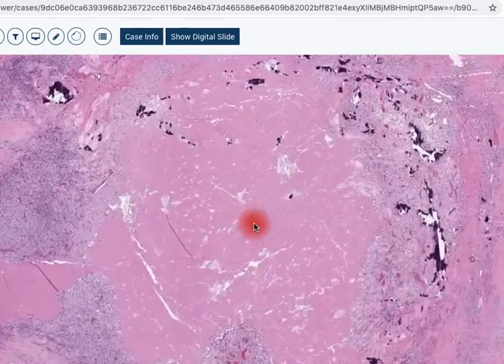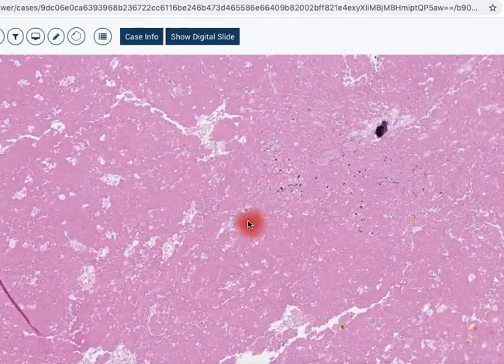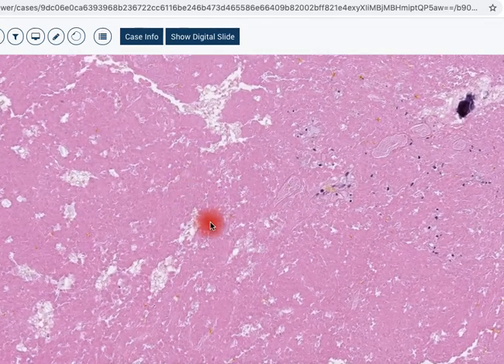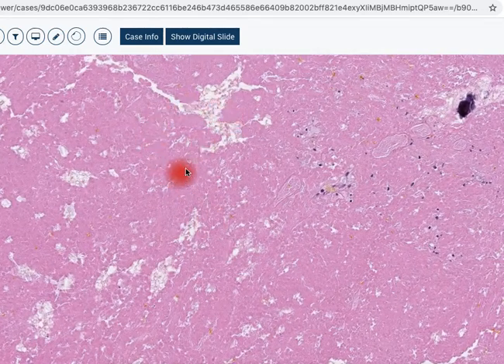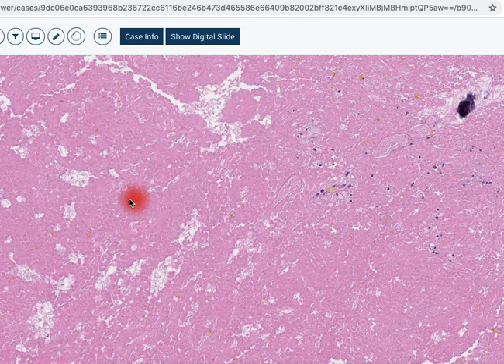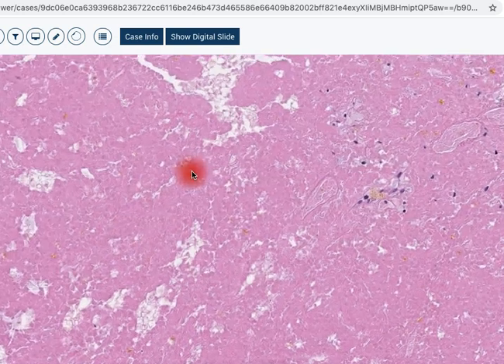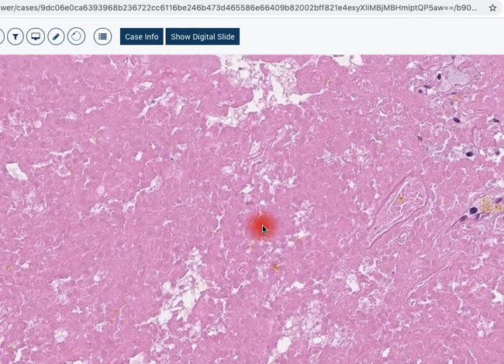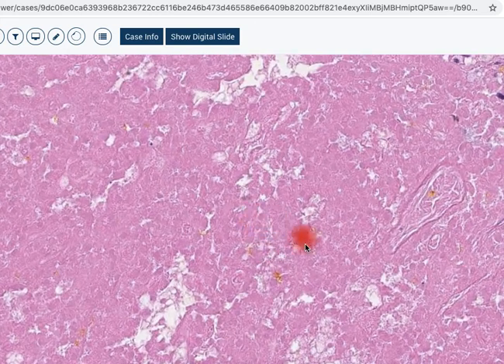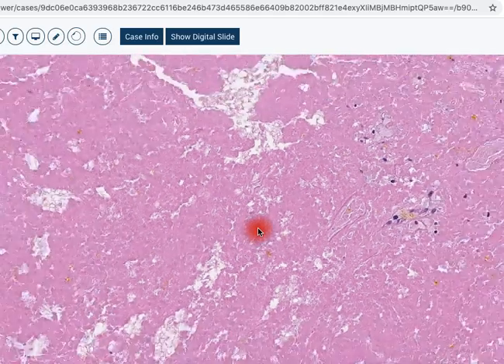If we look at the necrosis more carefully, we don't see too much here, other than a sense that there may be some sort of a tumor-type architecture lying in the background. So we've got some sort of a lesion that will necrose under certain circumstances. And you can see just barely maybe some of the little outlines of a few of the tumor cells, even maybe a little sense of a few of the nuclei here at higher magnification.